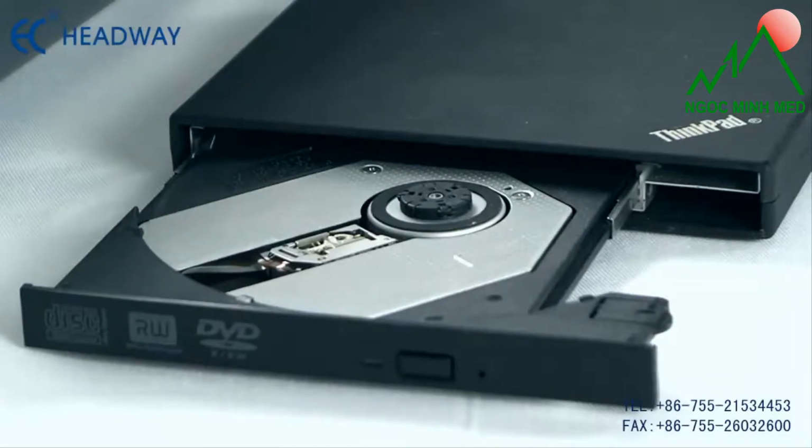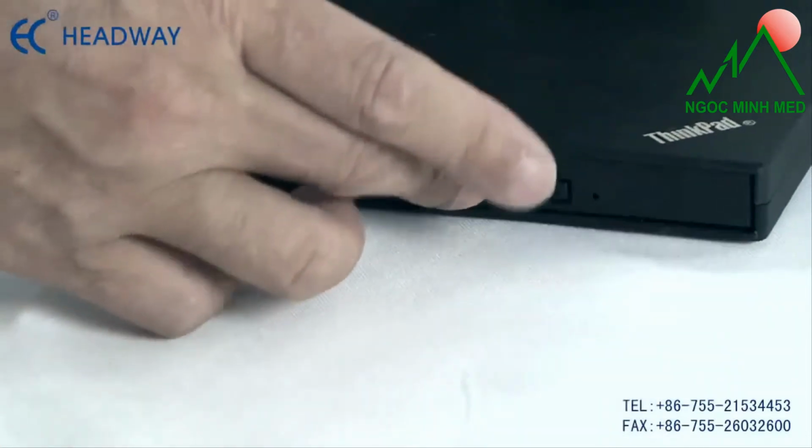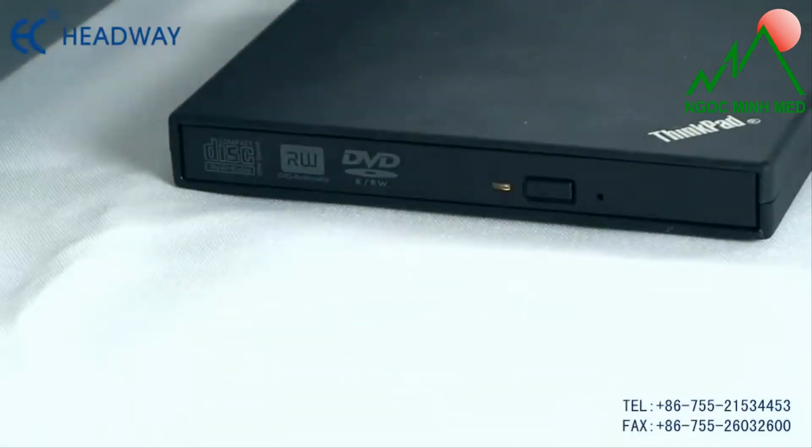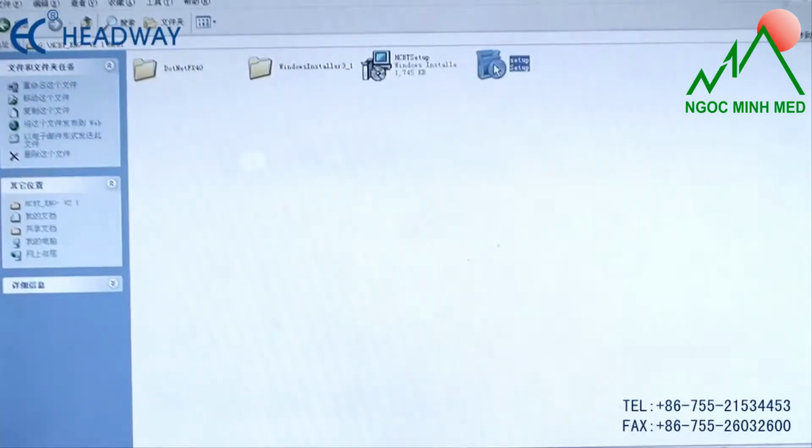The PC software installation of the instrument. Insert the equipment software CD-ROM of HUBT01 into the CD drive. The CD-ROM will run automatically. If the automatic running is disabled, please open My Computer, go into the CD drive root directory, and double-click the setup executable file.